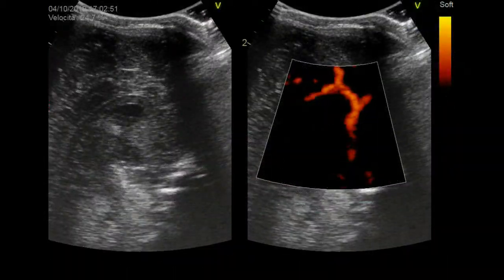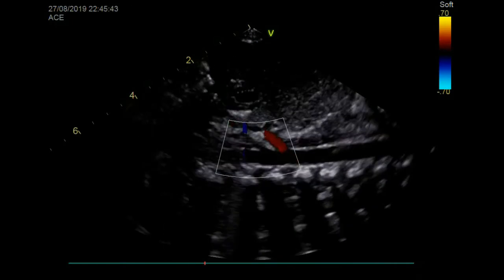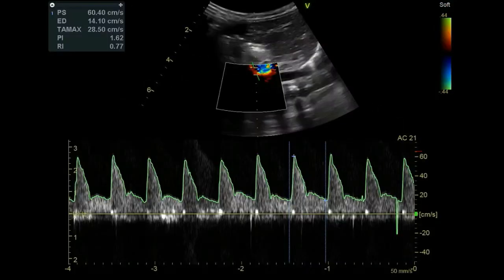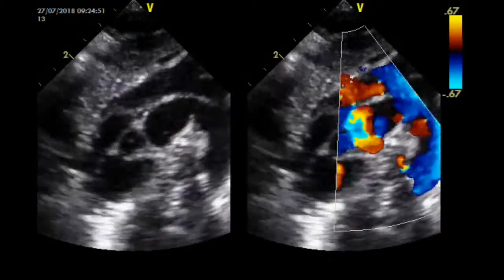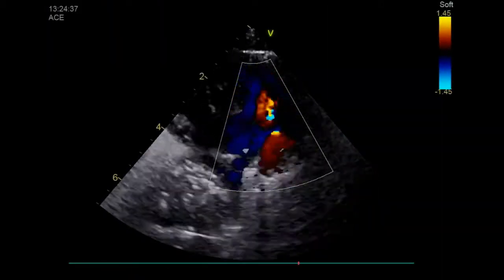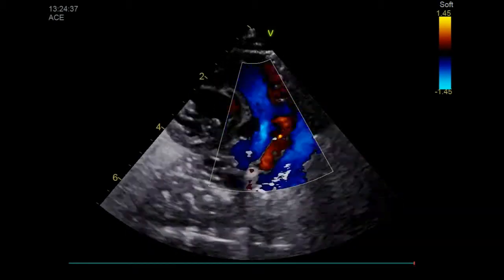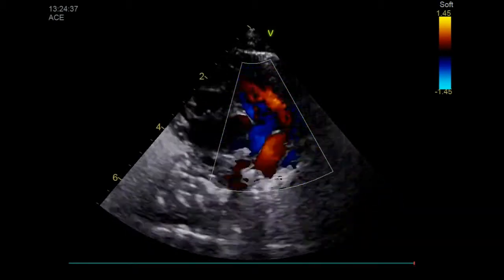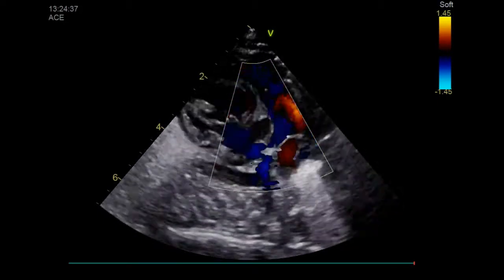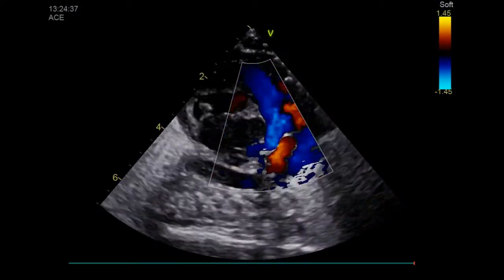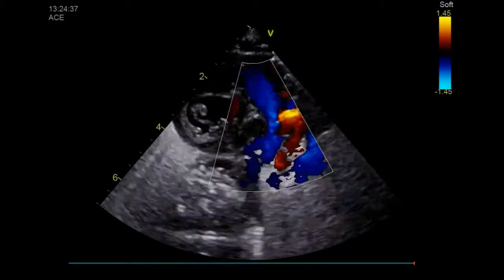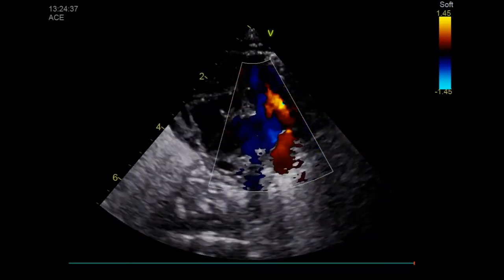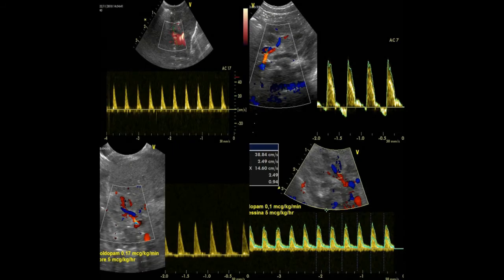Herein is represented the normal Doppler blood flow pattern in the pericalosal, celiac trunk, mesenteric, and renal artery. Although the PDA shunts blood away from the systemic circulation throughout the cardiac cycle, this becomes more apparent during diastole. Interrogation of the blood flow in the main systemic arteries using color and pulsed wave Doppler is useful to detect anomalies of end-organ perfusion due to PDA, and represents an important aid in staging the hemodynamic impact of the ductus on the systemic circulation.